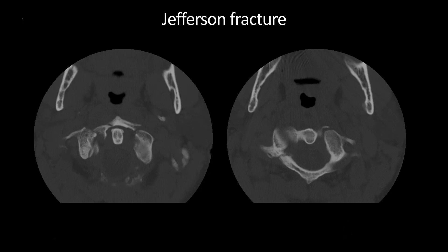On the axial CT images, there's the dens, the anterior arch of C1, and the lateral masses. Notice how we have fractures through both sides of the C1 arch anteriorly, as well as the posterior arch of C1 on the right. Also, carefully look for any potential vertebral artery injury, particularly if the vertebral foramina are involved.